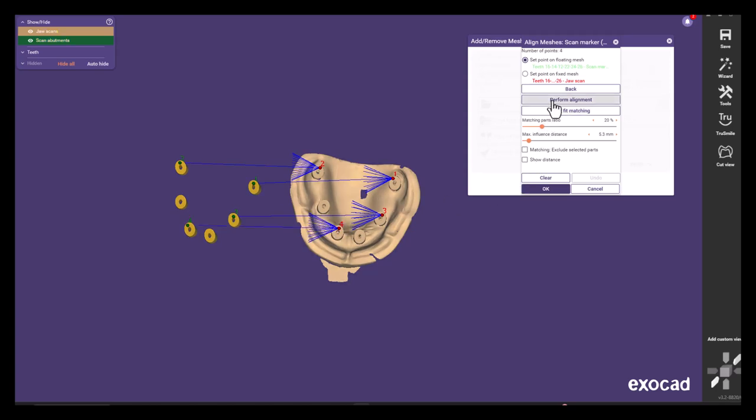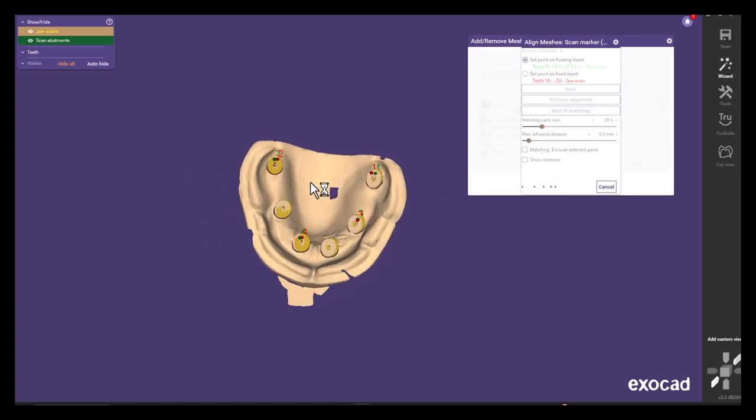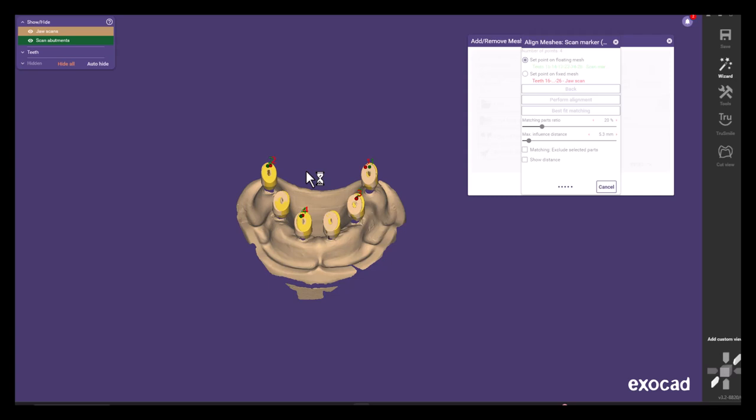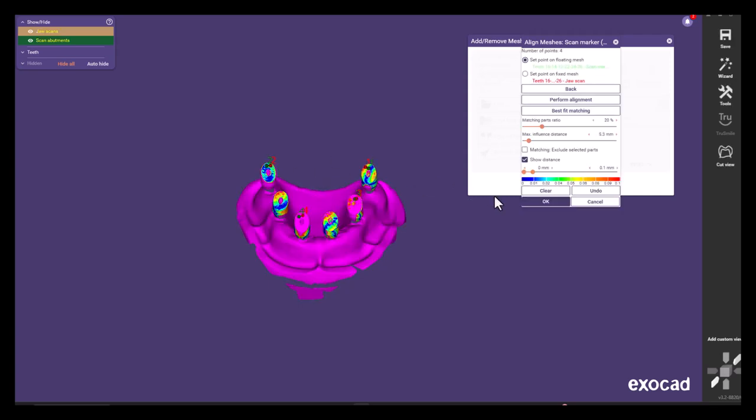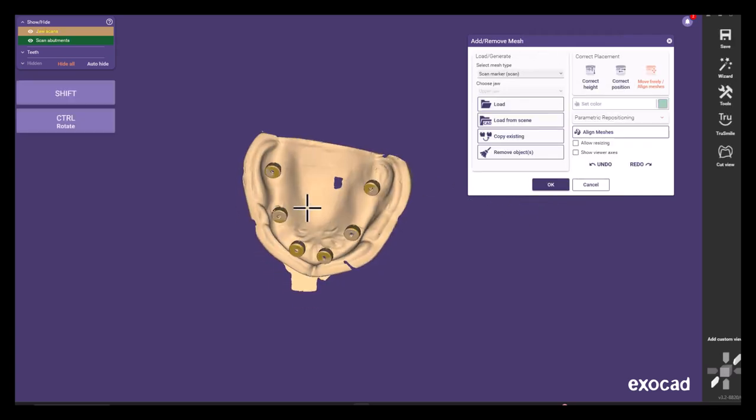Press perform alignment and best fit match right afterwards and then you can see the gradient that indicates deviation scale.